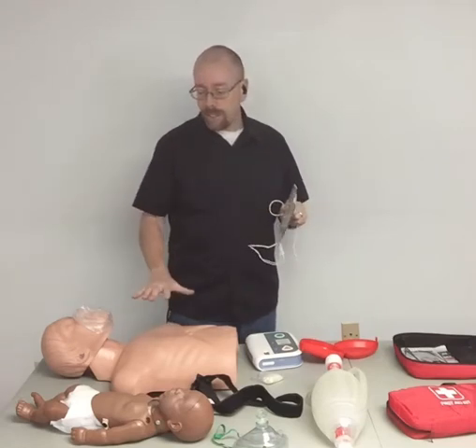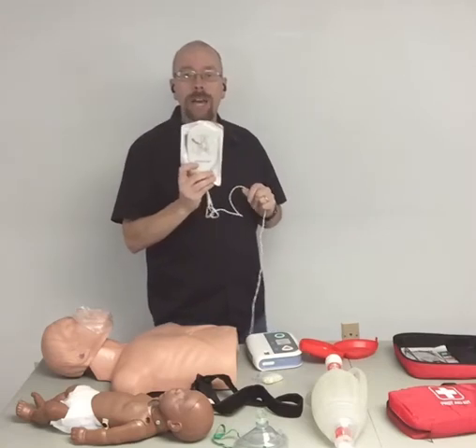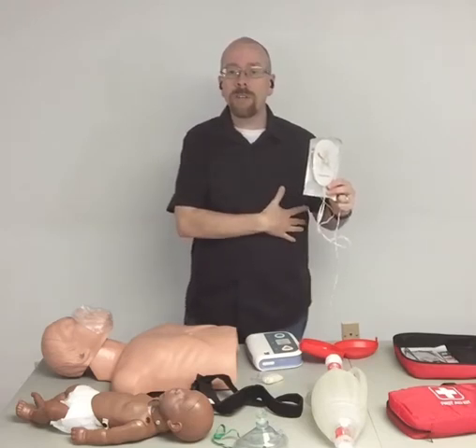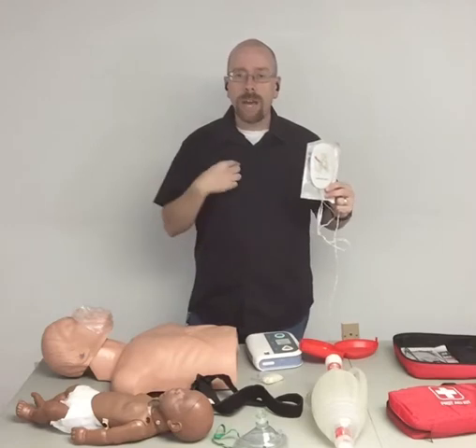Once the chest is clear, then we can apply the pads. We always look at the pictures on the pads, so these are adult pads, and it tells us to put one on the right clavicle area and one on the left lower ribs. It's always important to remember that the heart is between the two pads.